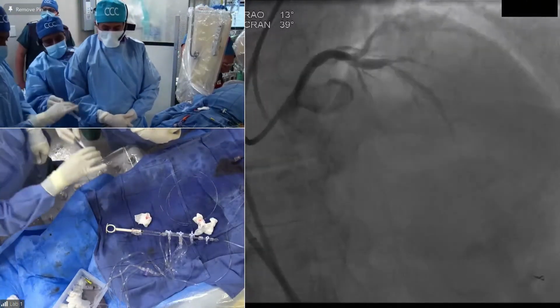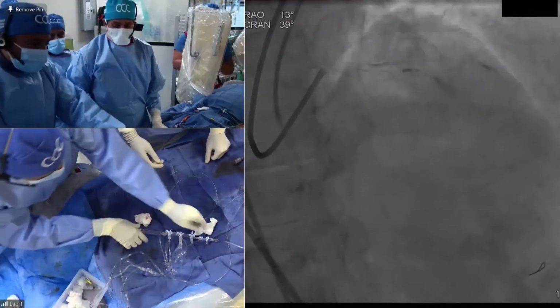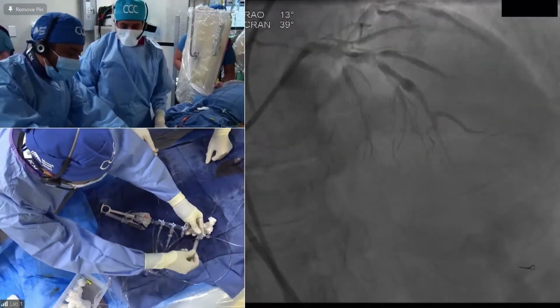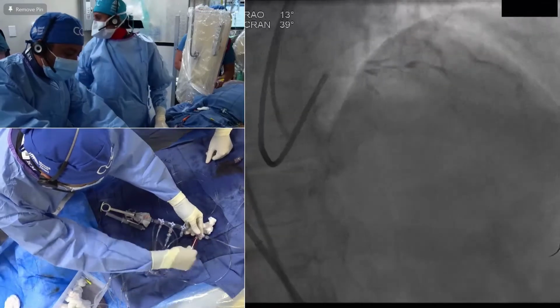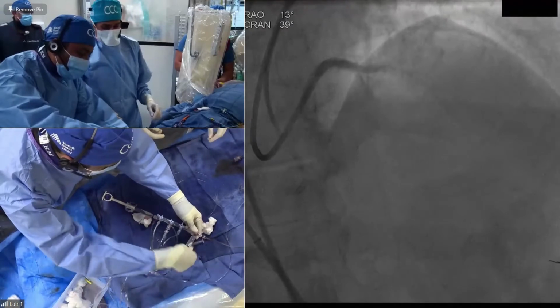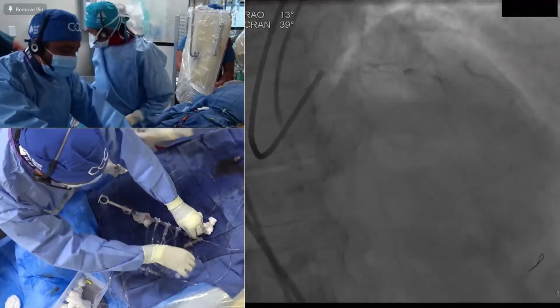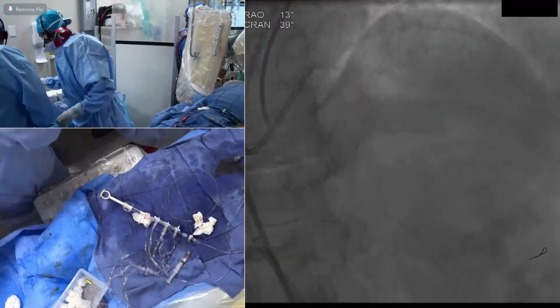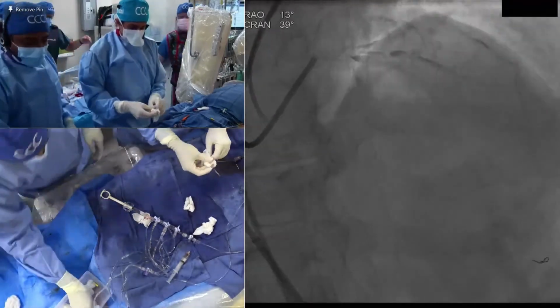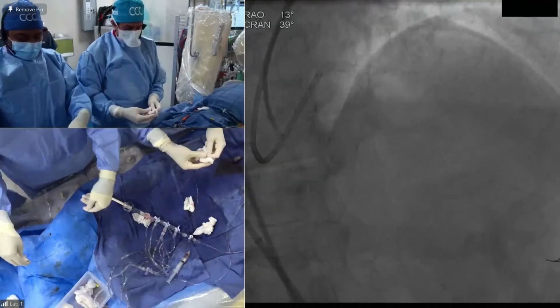I see Dr. Freeman and Dr. Kukar and then Dr. Tamis. We're just hearing of standalone cath labs, potentially not in hospital, and performing rotablator cases. Very soon coming up, apparently, in some areas of the United States. How would you feel performing a procedure such as this one in a standalone cath lab? Dr. Kukar first, and then Dr. Freeman, and then Dr. Tamis or anybody else, please. Just very briefly, and let them answer it, then I'll answer the final one on this field.